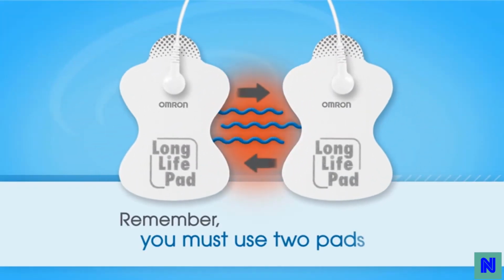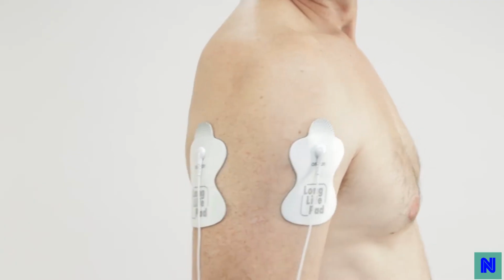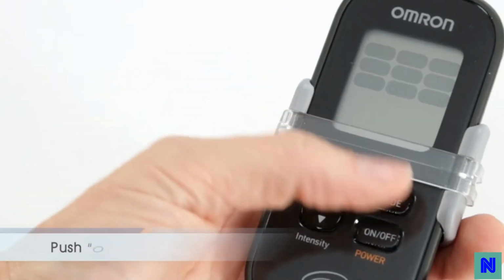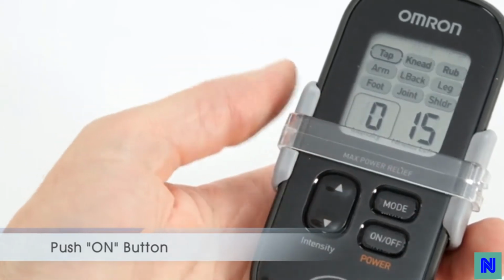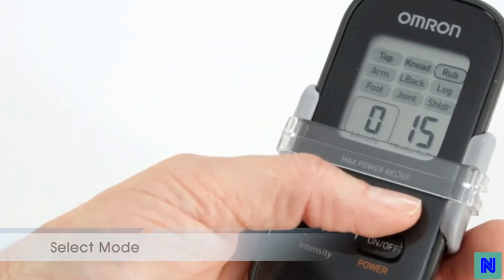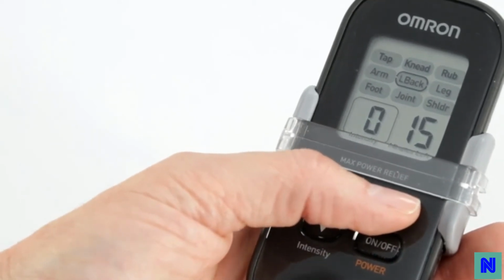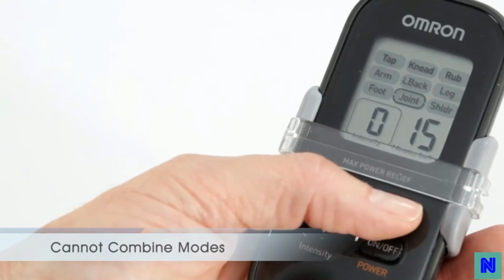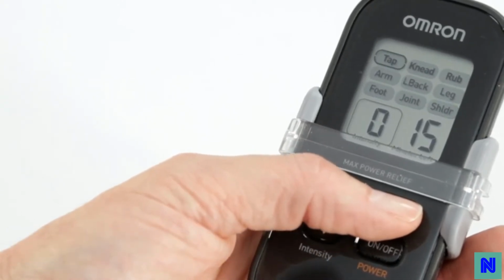Remember, you must use 2 pads for it to work. In this case, we are targeting the shoulder. Next, push the on button. Use the large screen and mode button to help you select the mode. Monitor your minutes left and manage the intensity. You cannot combine the modes, but feel free to use any of the modes on any pain.